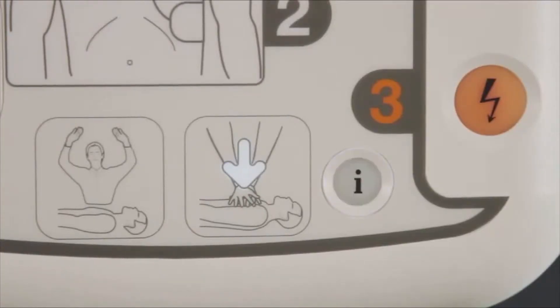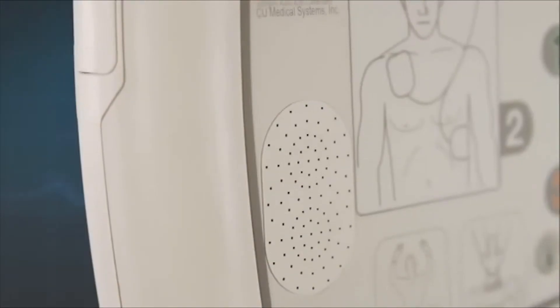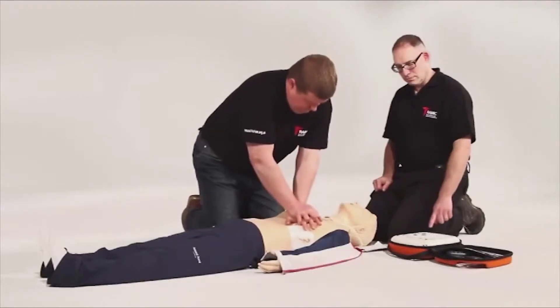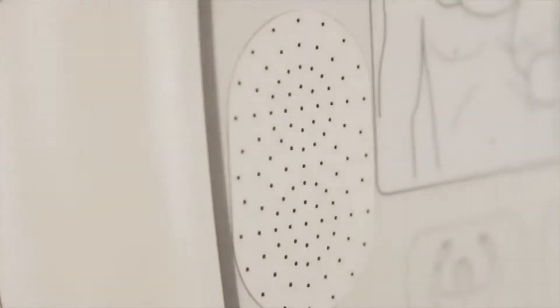Once again, the AED will say for help with CPR, press the flashing blue I button. This AED features a unique built-in ambient noise detector. This will automatically adjust the volume of the AED depending on the surrounding noise to a maximum of 90 decibels, which is particularly useful in noisy environments.